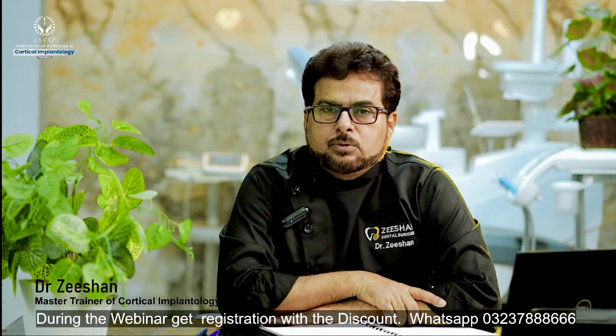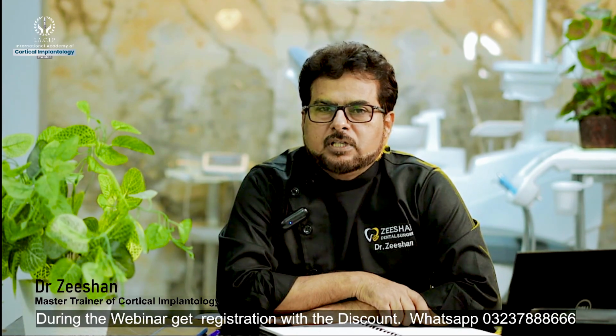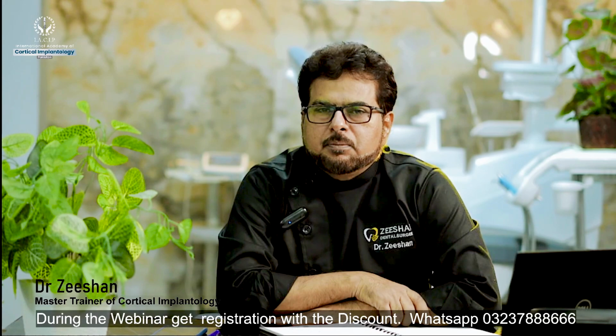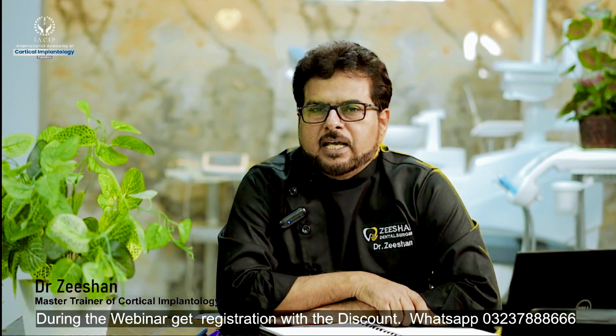So to fulfill all the needs of our patient for immediate loading of implants, we are choosing basal implants, or other systems that reach and engage the basal bone.